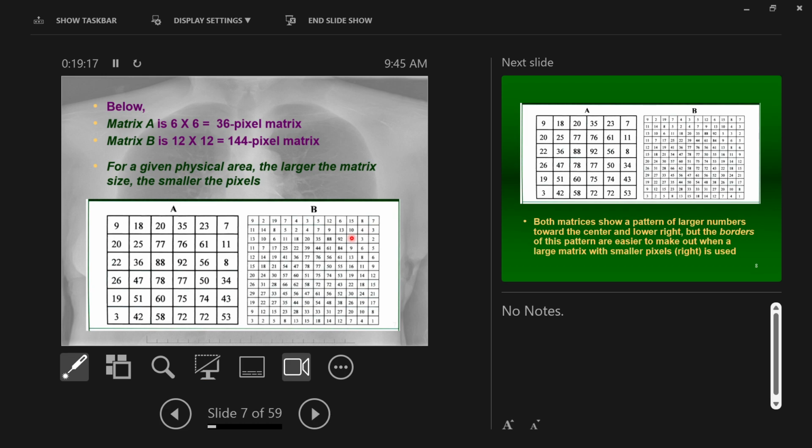Good. So when the area is fixed, like two computer screens of the same size, right? The one that you'll call higher resolution is the one that has more pixels in that physical area, a bigger matrix, and a bigger number of pixels. And you know this because this is how you choose TV screen resolutions and stuff like that, right? You buy 1080p TVs, or you buy a 4K TV. I think they even have 8K or some nonsense now, right?